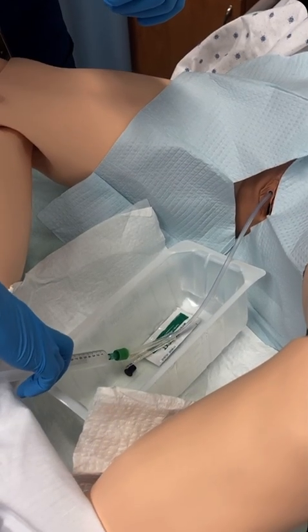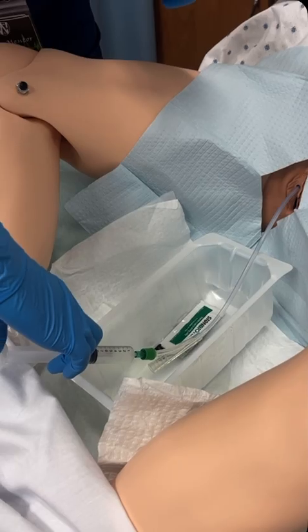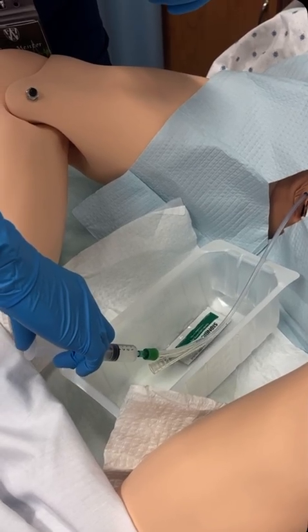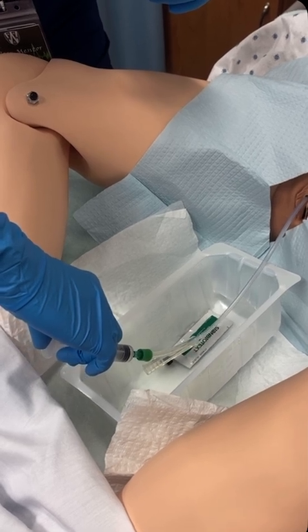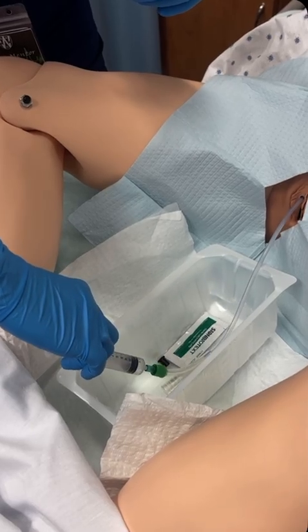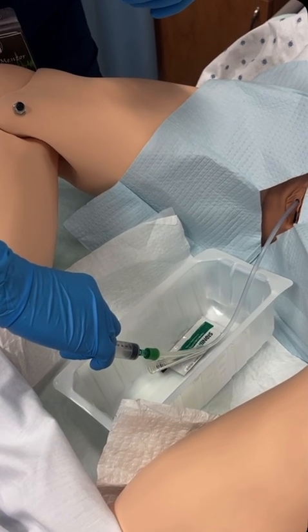States, if using an indwelling Foley catheter, inflate balloon as per manufacturer recommendations. If using a straight catheter, allow urine to drain. States, ask patient if there is pain on inflation of balloon. If pain is present, the balloon deflates and advances a little more. If pain is present on the second attempt, states would obtain assistance.